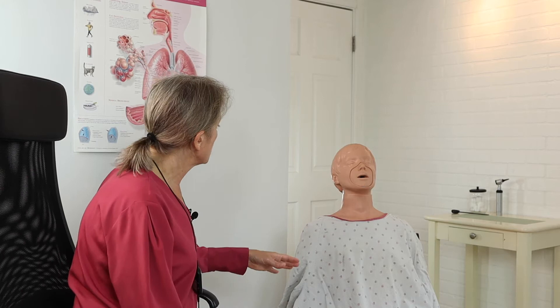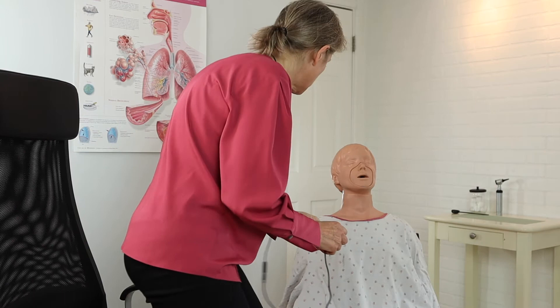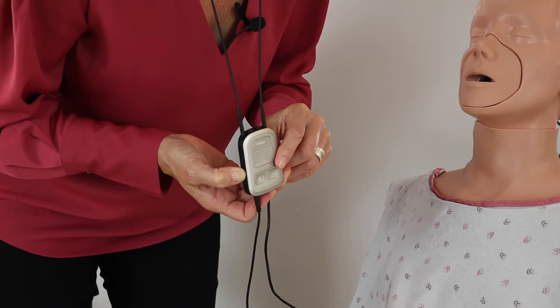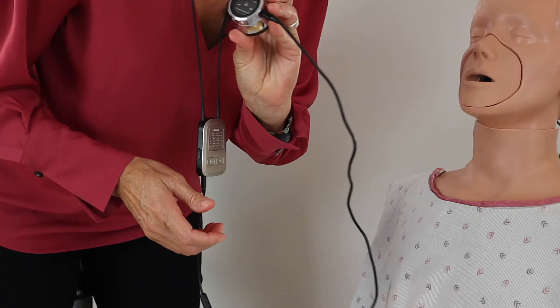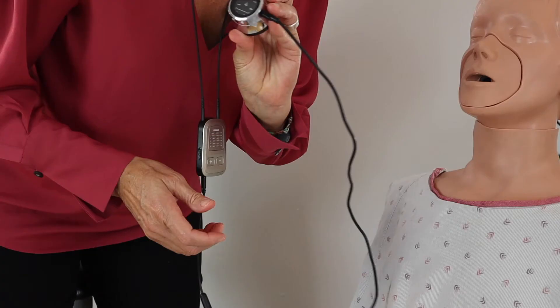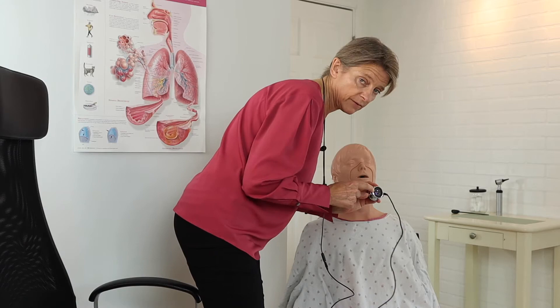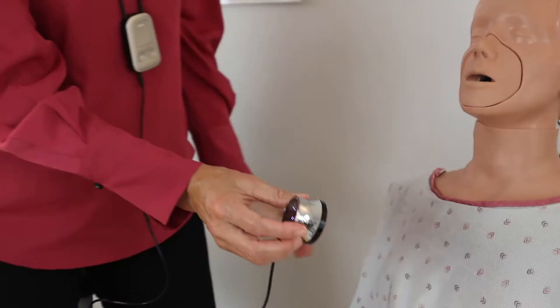Mr. Joe, we're going to be talking about your lungs — we want to address your asthma and make sure that you're on the right medication so that you don't keep having asthma attacks. I want to listen to your lungs. So first we go ahead and turn on the streamer — you'll see I have a button on the side and the light turns on. It says to me 'Compilot is on.' It's green, meaning that it's through an audio source. If it were blue, it would be Bluetooth. But this is direct audio. Then I go ahead and turn on my stethoscope, hit these two buttons, and you'll see the light turn on. I always like to tap my stethoscope to make sure I can hear it.